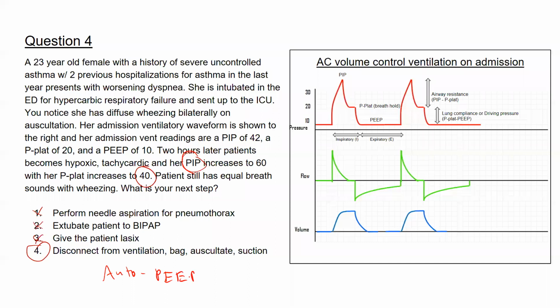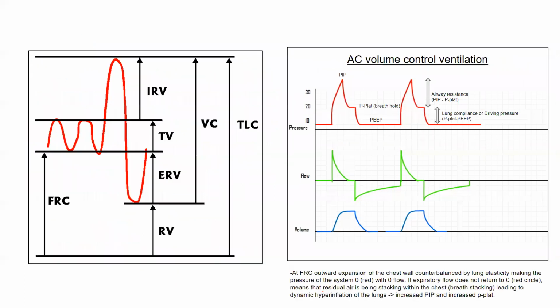Auto-PEEP is also known as breath stacking, and I think it's easier to think about it as breath stacking. Looking at this next slide, we're going back to the inspiratory curves, which I think is helpful. This is inspiration, and then you expire. Remember, inspiration here, expiration here. Your inspiration should equal your expiration.